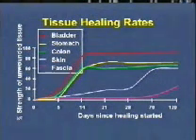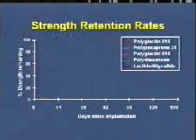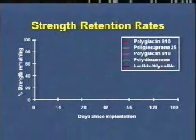The rate of tissue healing, combined with the factors which affect wound healing, must influence the choice of suture material. Just as there are many factors to be considered in relation to the healing wound, there are many factors in the performance of absorbable sutures and their resulting contribution to successful wound healing. There are two aspects to consider: actual suture strength and how long is strength maintained.